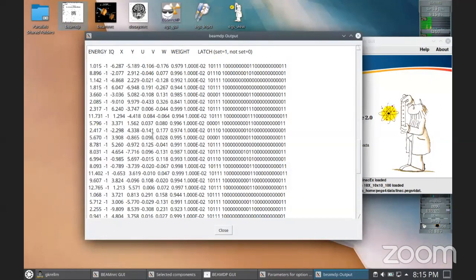You can also get the spectrum. Suppose you want the spectrum. Suppose we're interested in this. I don't know why, but suppose we're interested in that. So I select electrons. I can put -30.